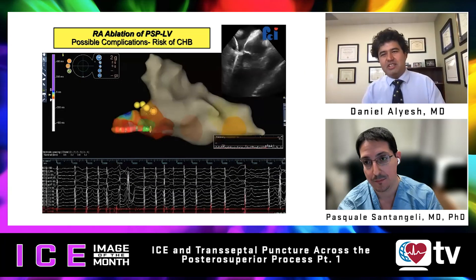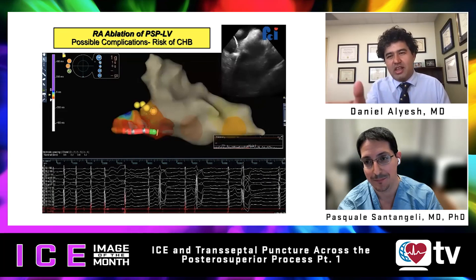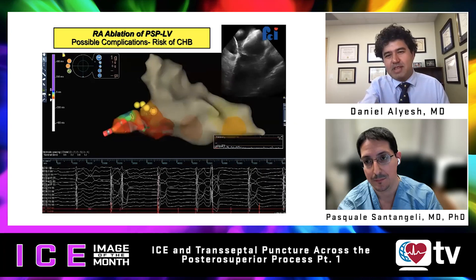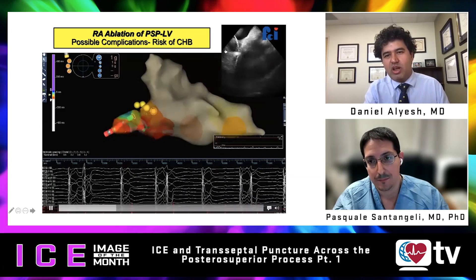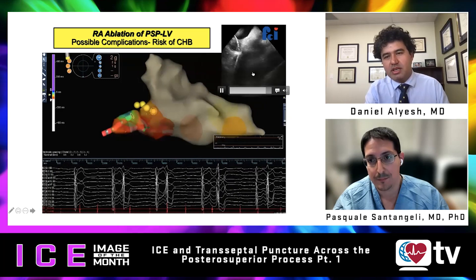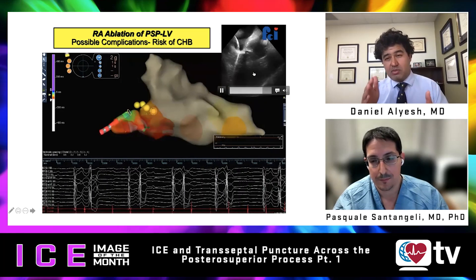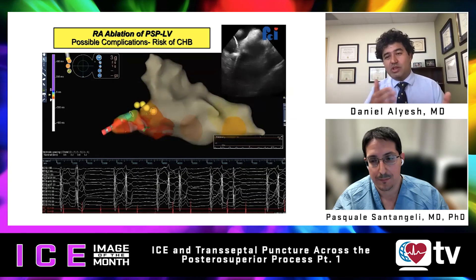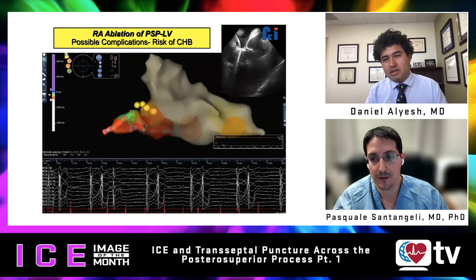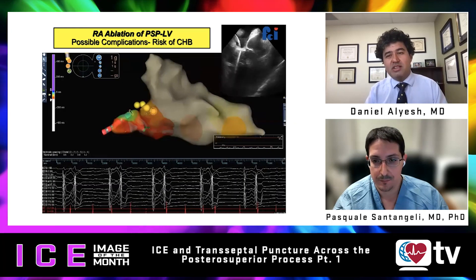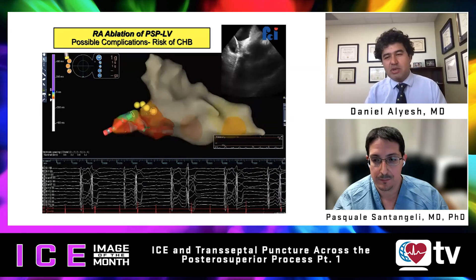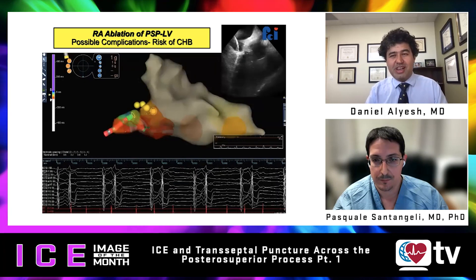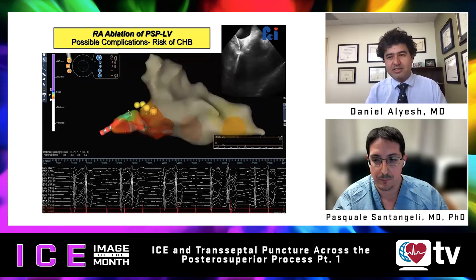To orient viewers: in the ICE view, you can see the aortic valve, the non-coronary cusp, the left ventricle, and — below the ablation catheter — the tricuspid valve. If the catheter drifts more ventricularlly toward the slow pathway region, this complication can arise, and ICE helps tease out this anatomy. The compact AV node is remote from this specific region in most patients. We look forward to episode two, focusing on transseptal puncture.